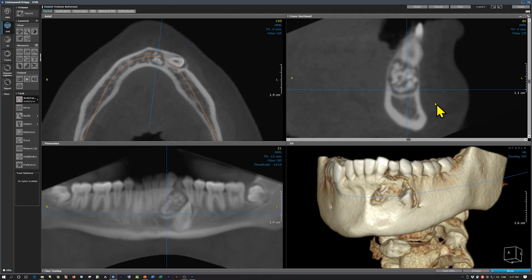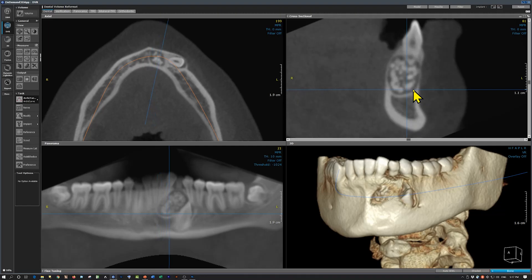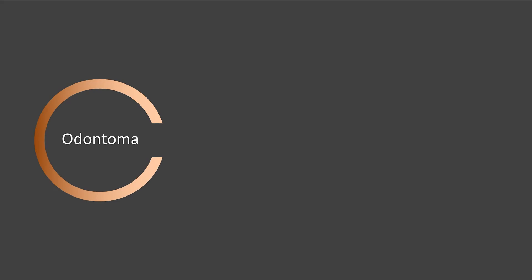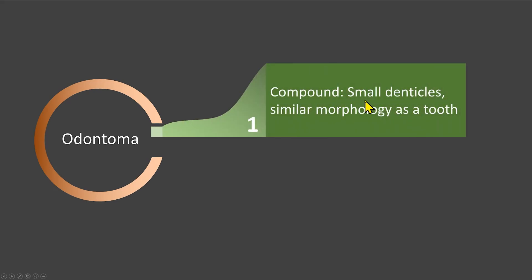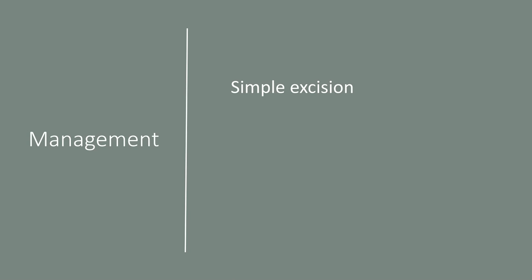As we went through, we did not see any signs of a morphological similarity to a tooth structure, so this would be a complex odontoma. An odontoma can be of two types: compound, where we have small denticles similar in morphology to a tooth, and complex, which has no morphological similarity to a tooth structure, as seen on our radiograph. Management is a simple excision and removal of the odontoma, which is sufficient with no recurrence.